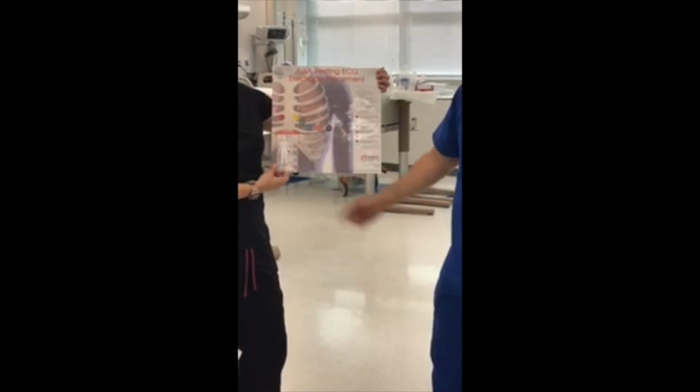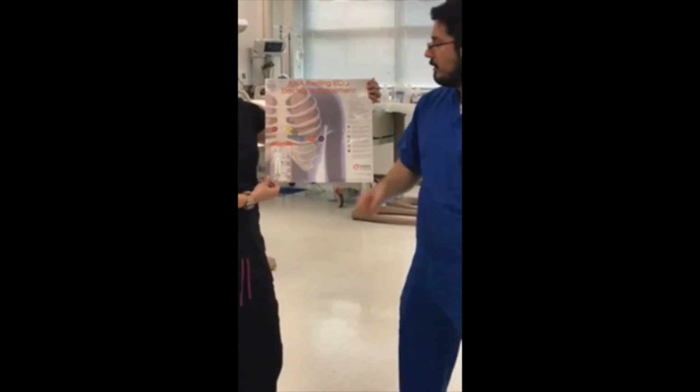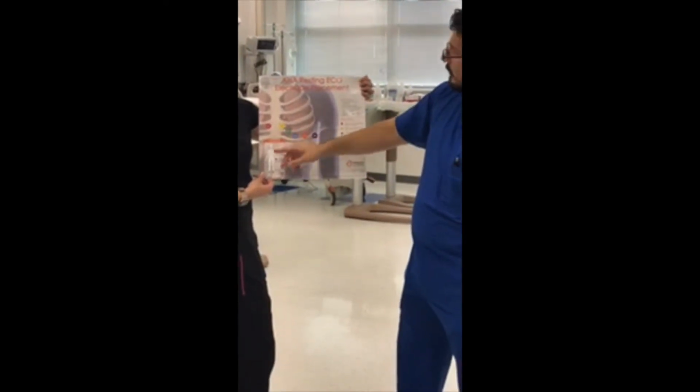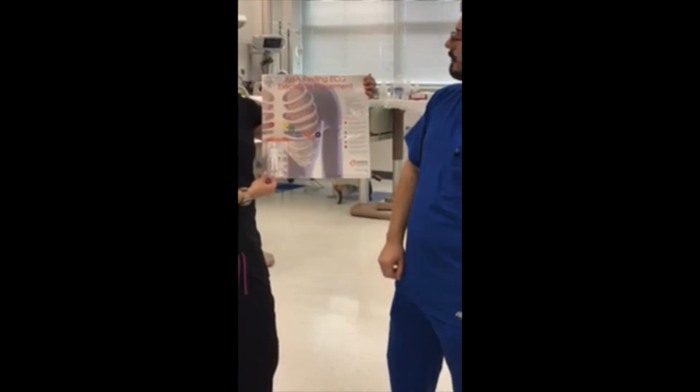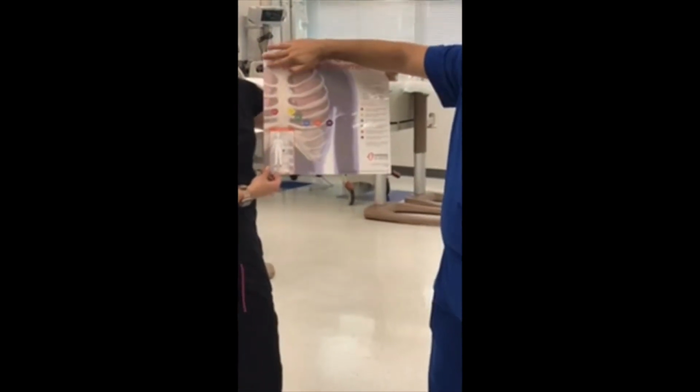So V1 is on the right side of the sternum, and it is down on the fourth intercostal space. It is important to be able to palpate your intercostal spaces by the ribs.